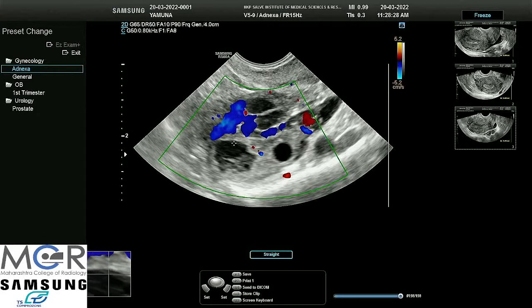This follicle appears irregular. We are seeing internal echoes. So maybe today is her ovulation day. Maybe. Because she came with complaints of pain in abdomen since yesterday. So her clinical complaints are fitting with the findings. She had pain in the lower abdomen on the left side. And today is her 15th day of menstrual cycle. Endometrium is also showing that 3-line sign going into secretory phase, and follicle rupture and fluid in POD.